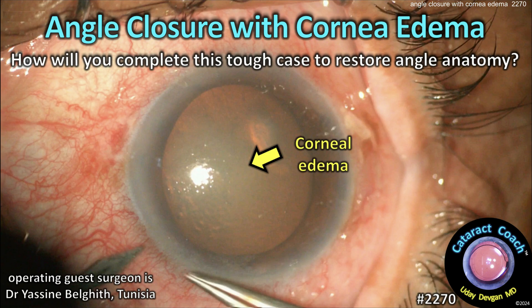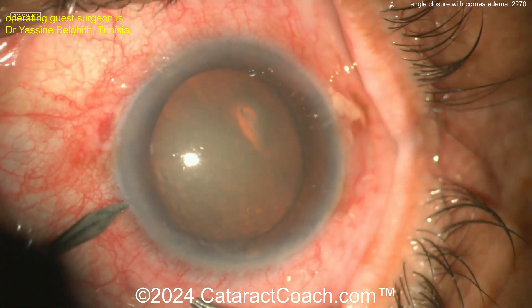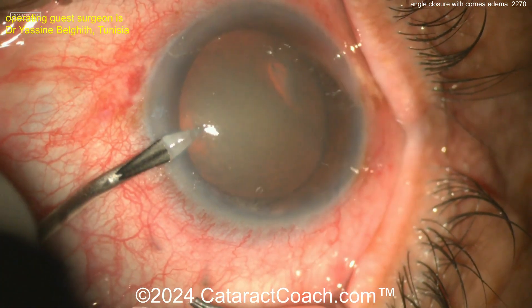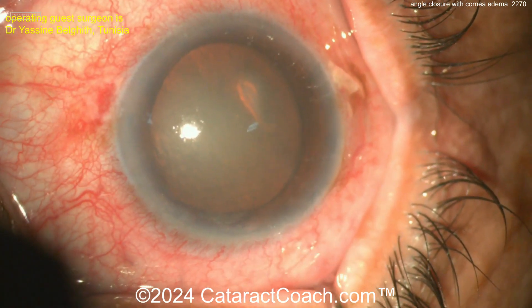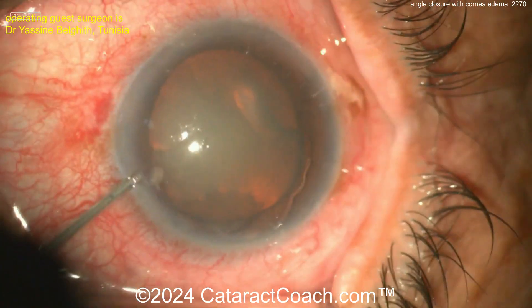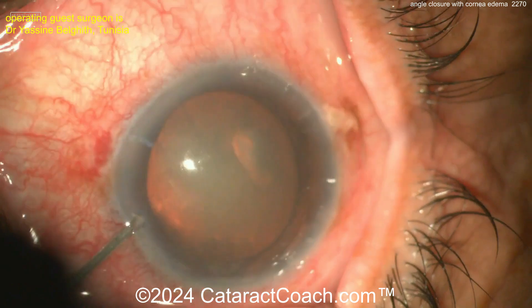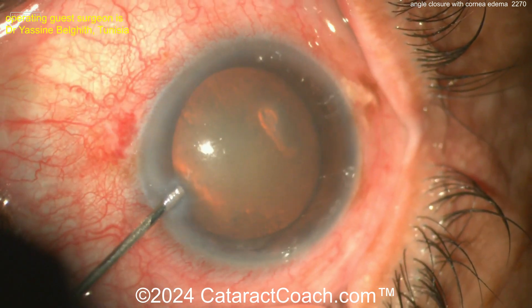CataractCoach.com: angle closure with corneal edema — how will you complete this tough case and restore the angle anatomy? Looking at the light reflex, the Purkinje image on the cornea, you can tell there's some corneal edema. That reflex is not so good. This patient has angle closure glaucoma issues as well as corneal edema from that.